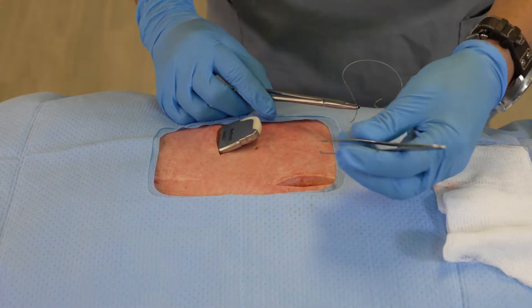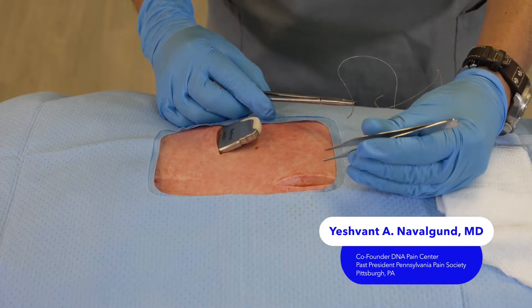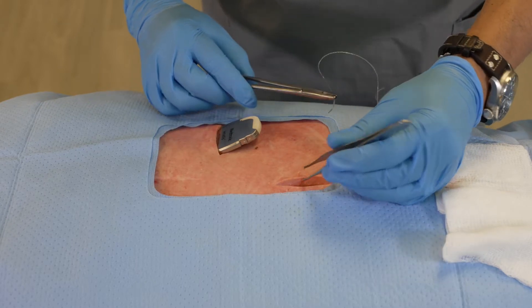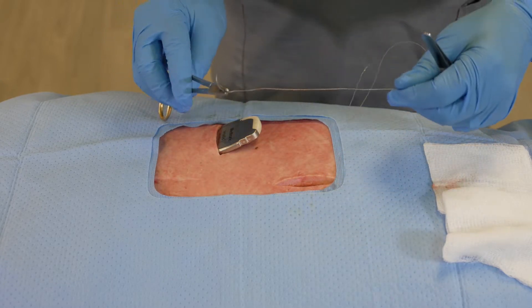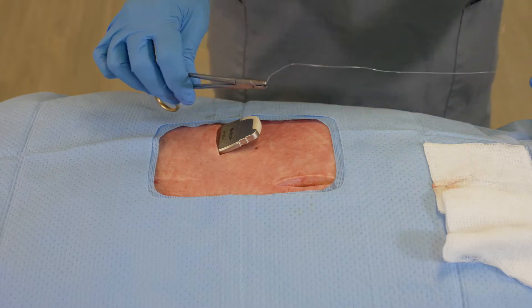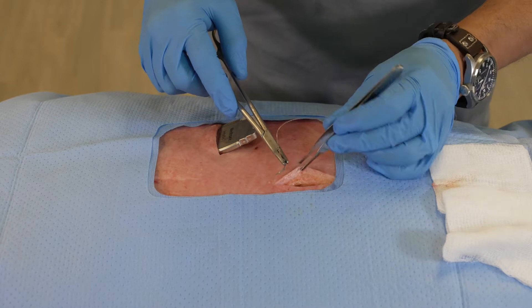What I have here is an example of an implanted spinal cord stimulator system. We have a lead implanted and we are looking to close the thoracic incision. I'm using V-lock 2-0 barbed suture in order to achieve this closure, and I'm going to do this in a two-layer fashion.